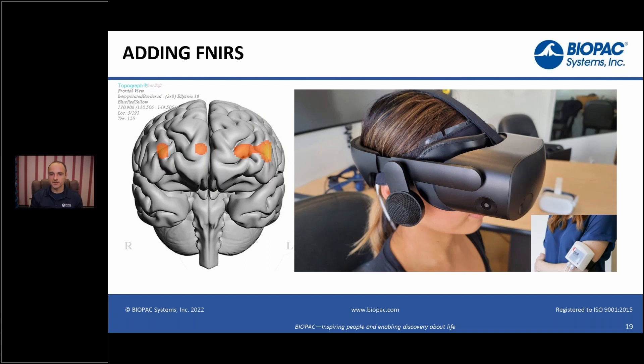You can also record functional near-infrared. You can see here our functional near-infrared system, and I'll grab a sensor so you can see it. This is the sensor for the functional near-infrared system — it's very thin, and as you can see it fits under and can be mounted under a display like the HP Omnicept.